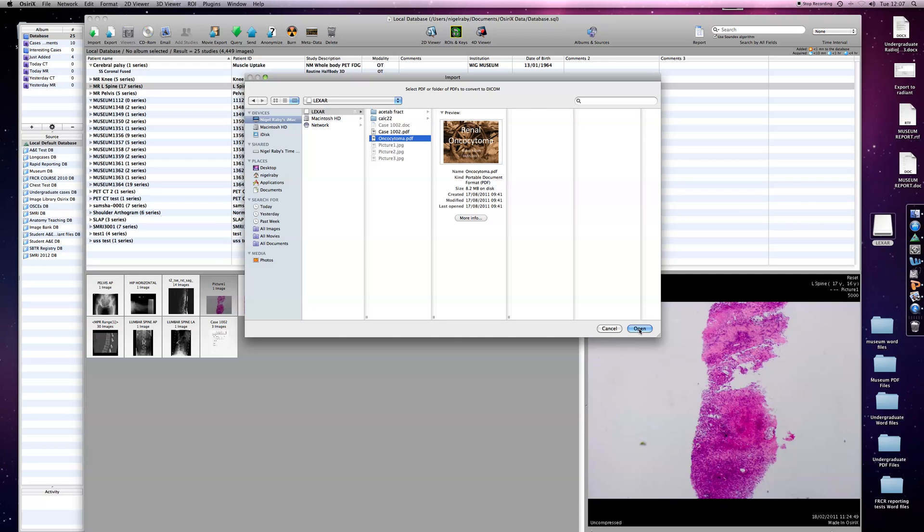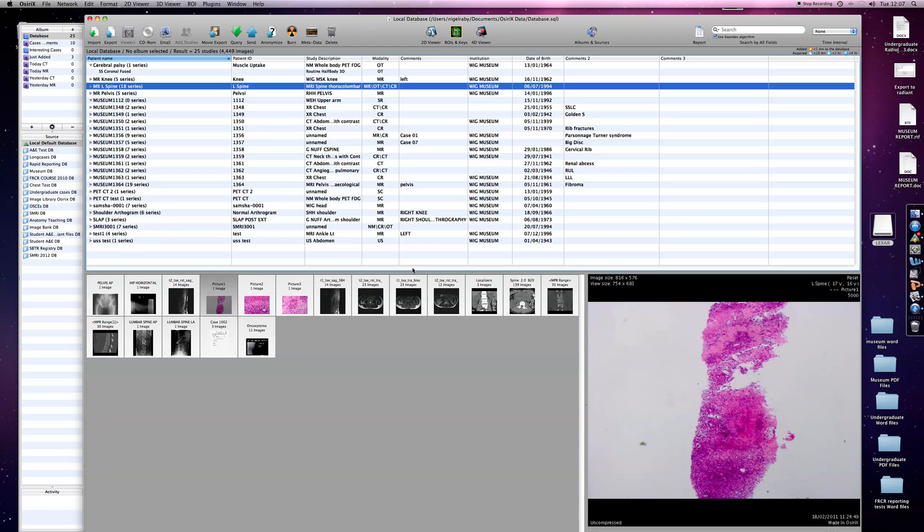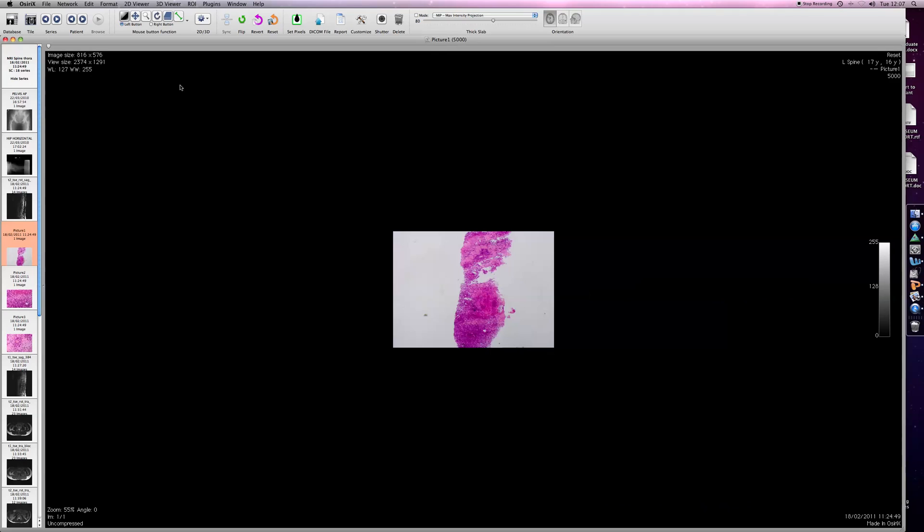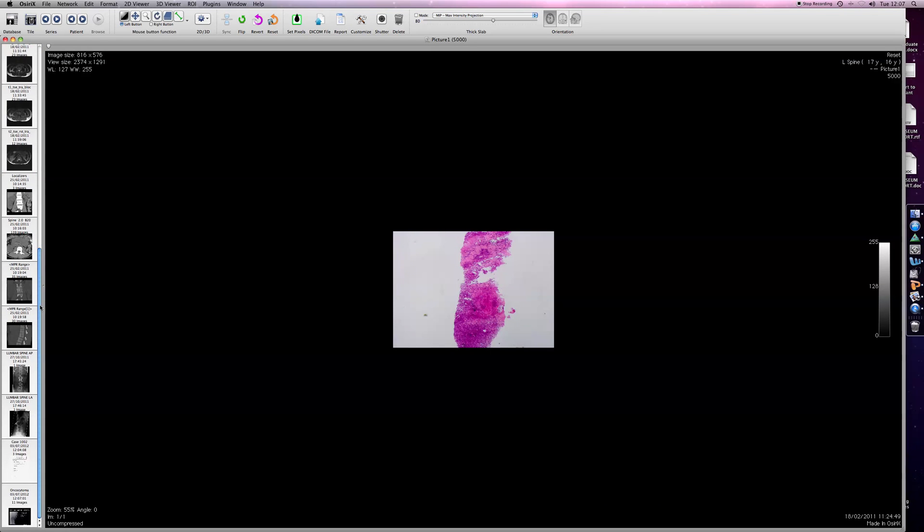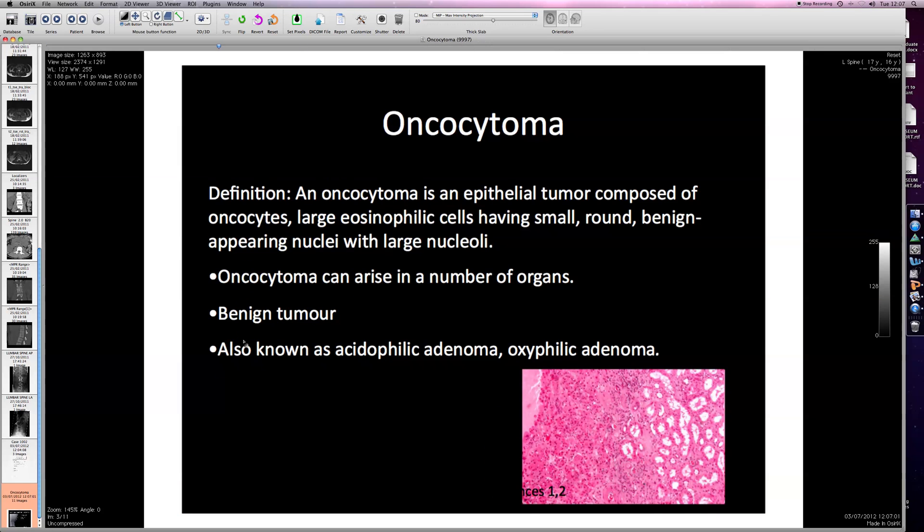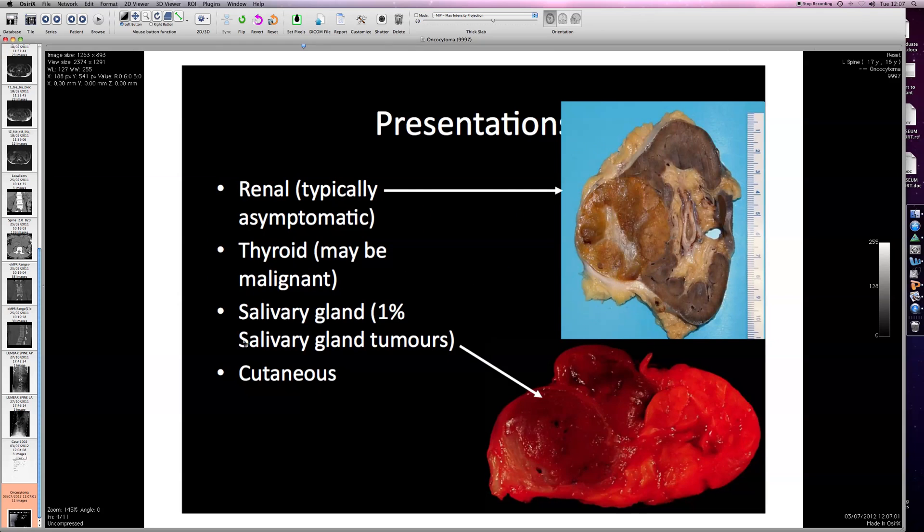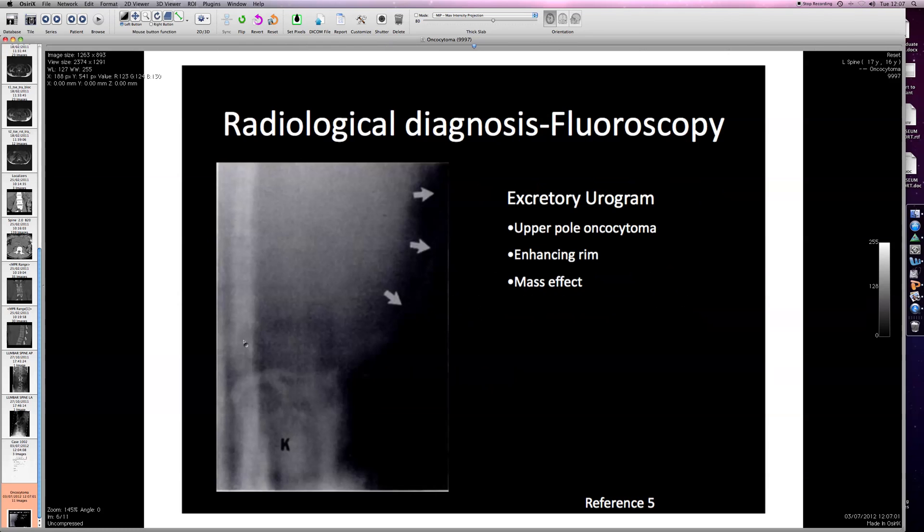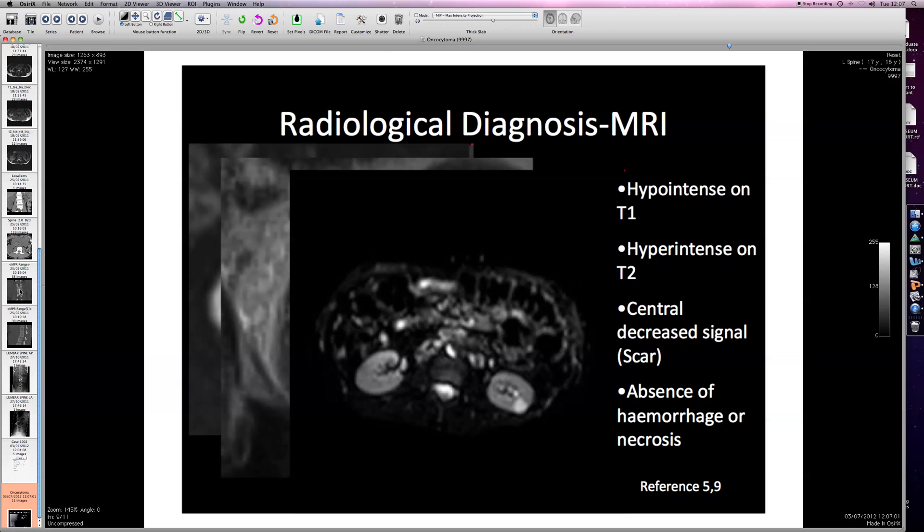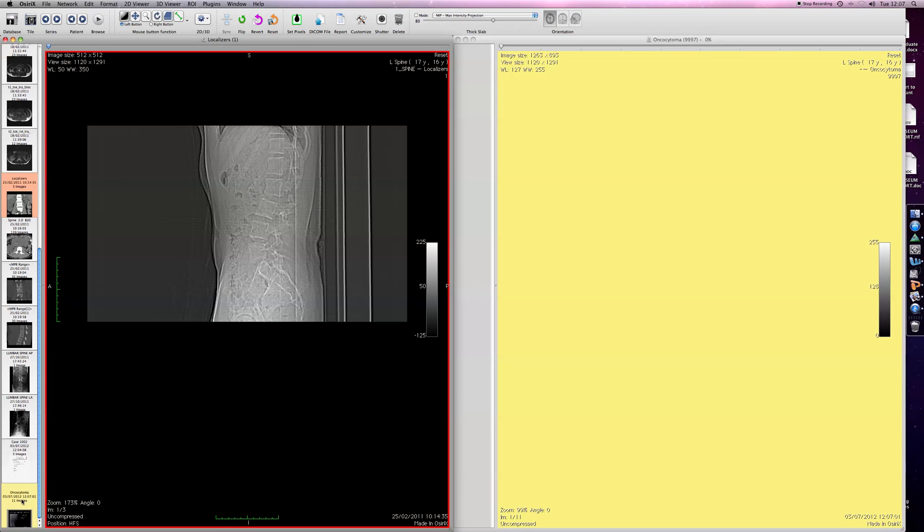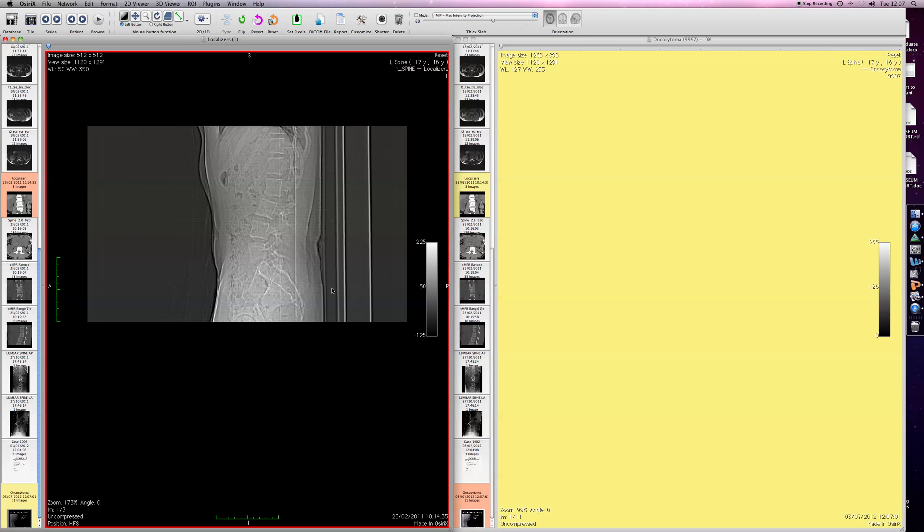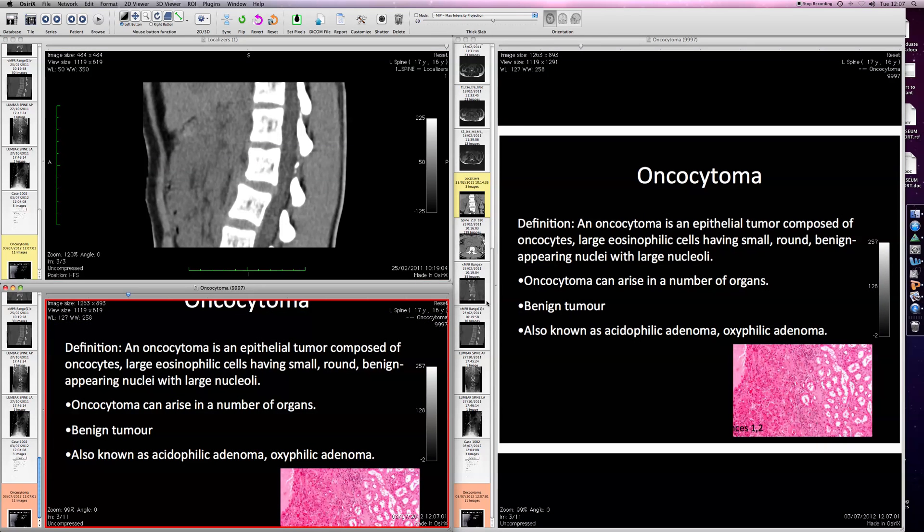That one, for some reason, has popped straight in without any need to merge it. That happens from time to time, and I don't know quite what the rules are. However, I click on that, then I have a PowerPoint-type presentation saved as a PDF file. Obviously, if that was relevant to the case, you could have it up beside an image so that you could look at the images and the PDF file at the same time.